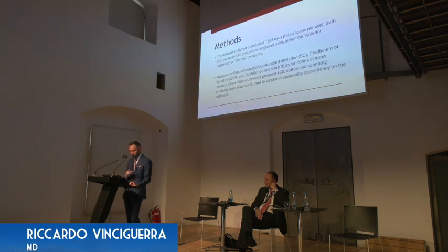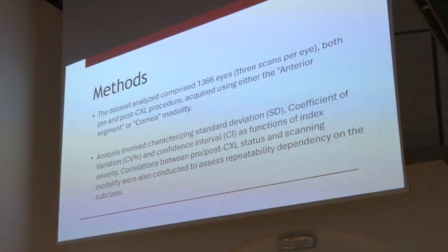So basically, we had about 1,366 eyes. We also had patients after cross-linking, and I'm going to tell you why. And we created noise levels. So we measured the patient 3 times, and with this, we were able to create the noise level.